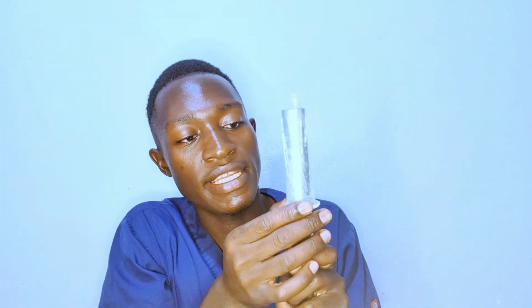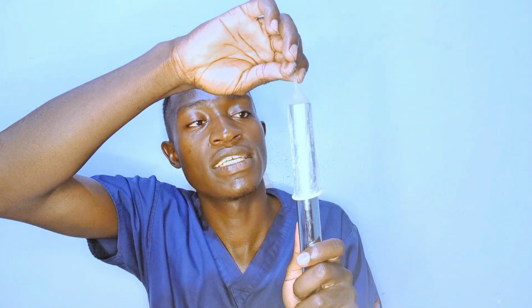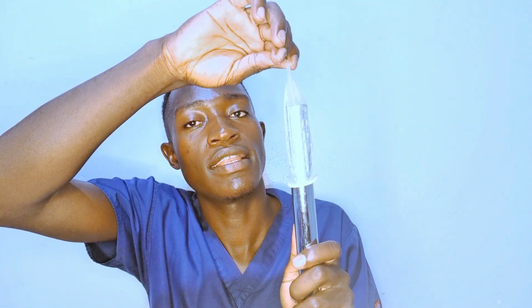One hand holds here and the other supports, and you remove it carefully like that. You should ensure that in the process of removing the condom, you do not let the semen come out from the penis.